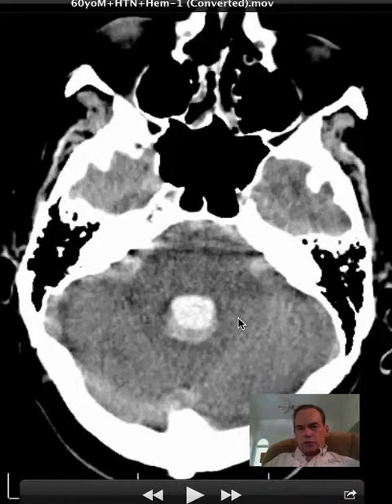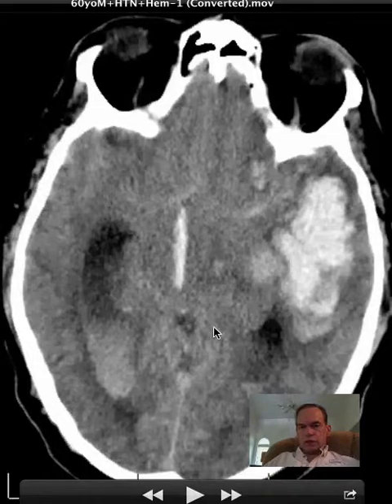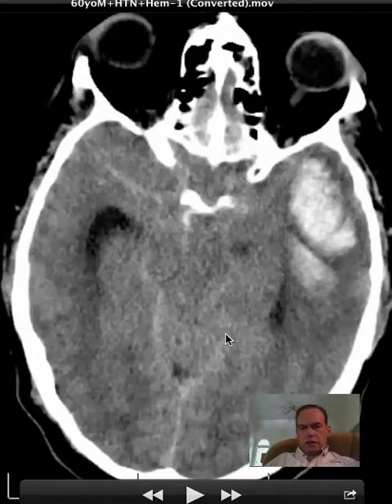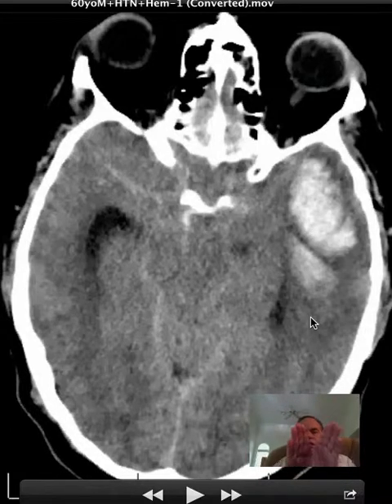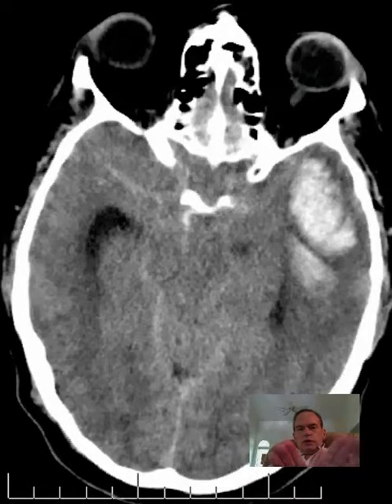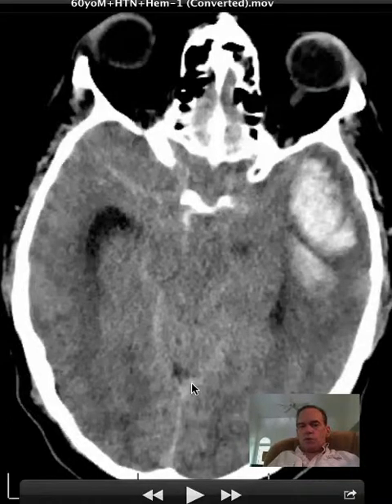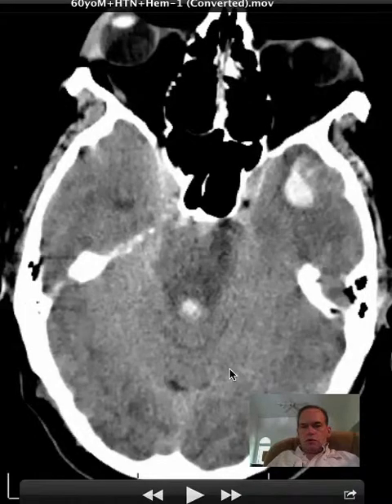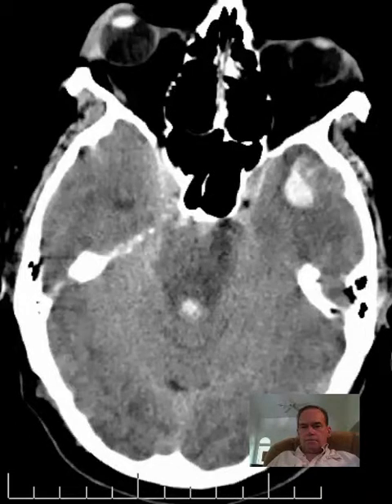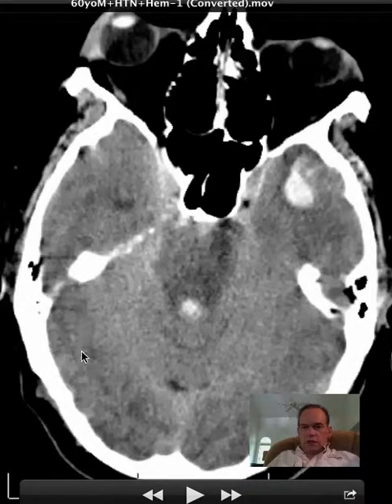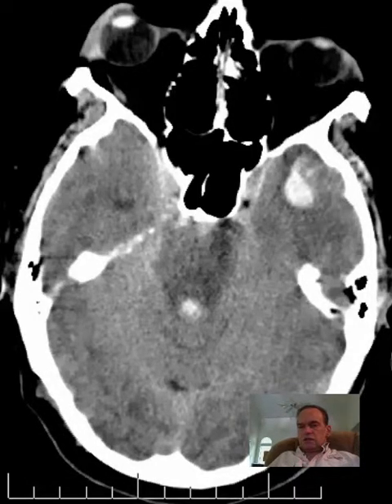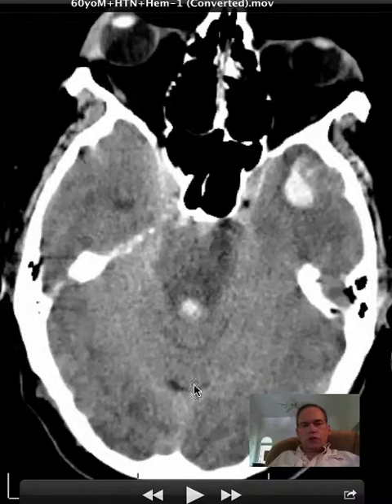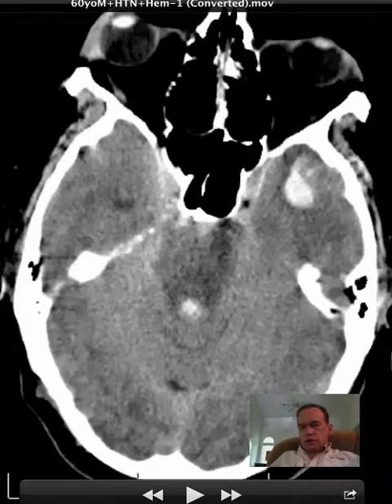There's not much mass effect in the posterior fossa because the tentorium is blocking it. The tentorium you can see here and here at successively lower levels because it is shaped such that it allows the brainstem to pass through it, so the leaves — the margins of the tentorium — are farther and farther apart on successive levels. On this view, this is posterior fossa and this is posterior cerebral hemispheres. It's difficult to conceptualize, but I encourage you to appreciate that an axial cut will have both posterior fossa and supratentorial structures on some of them.